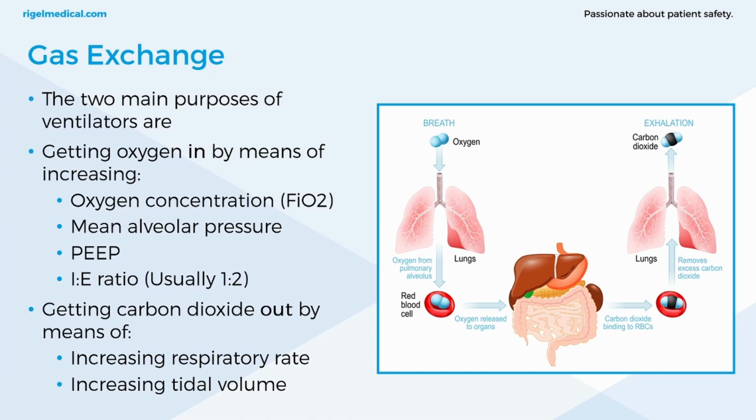And providing a higher PEEP level is what CPAP machines do. They apply a constant low pressure just above ambient pressure, and you can change those values within CPAP machines. And what it's doing is preventing the alveoli from collapsing. Now I've heard a good analogy on this when I was doing my research on ventilator testing. If you think about it like blowing up a balloon, it's always that initial resistance that makes it difficult to inflate. But once the air expands into that area, it becomes much easier. And that's how an increase in PEEP is helping the lungs.